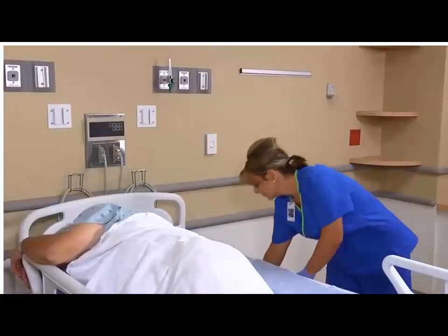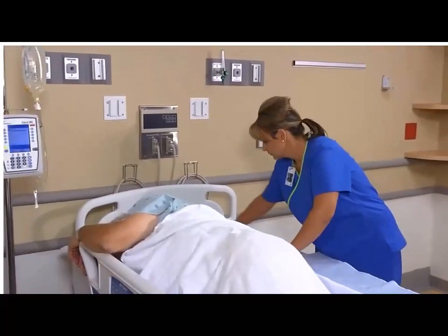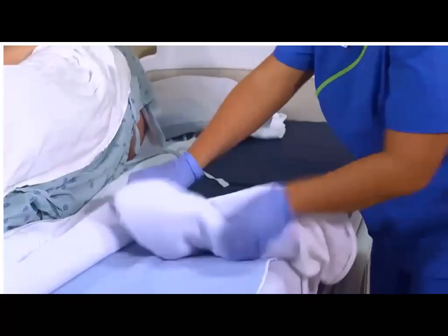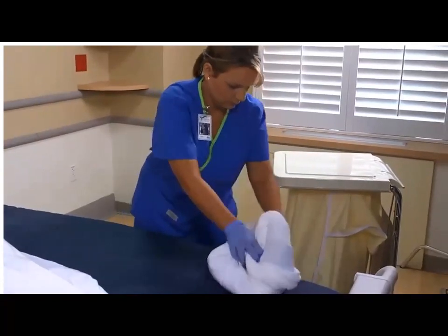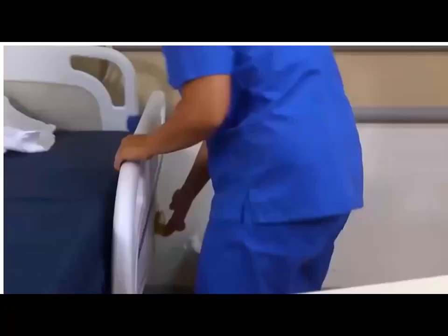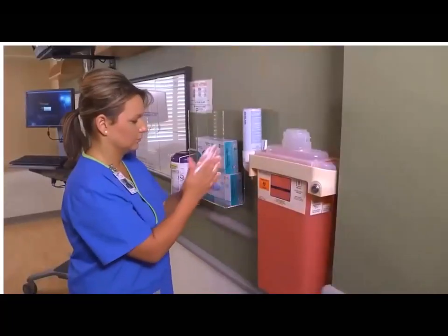Move to the opposite side of the bed and lower the side rail. Loosen the edges of the soiled linen from beneath the mattress and remove it by folding it into a bundle or square and holding it away from you as you place it in the linen bag. Then clean, disinfect, and dry the other half of the mattress if necessary. Remove and dispose of your gloves. Raise the side rails. And perform hand hygiene.